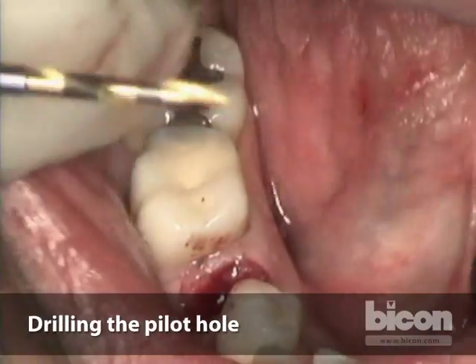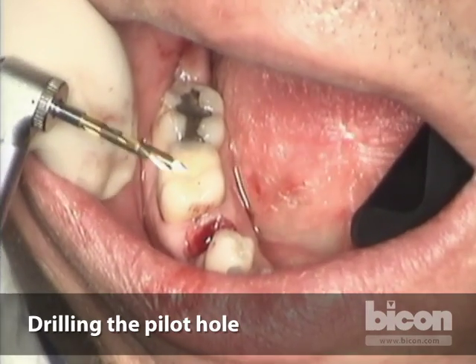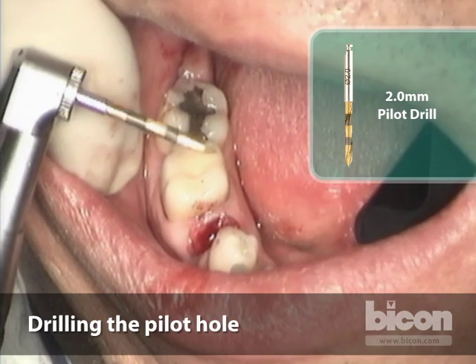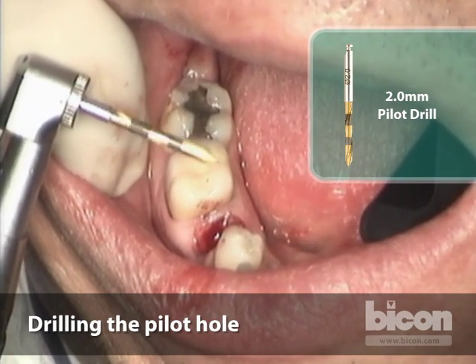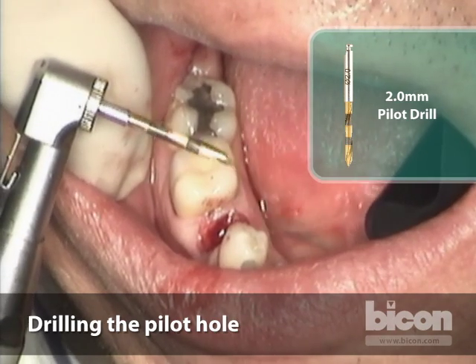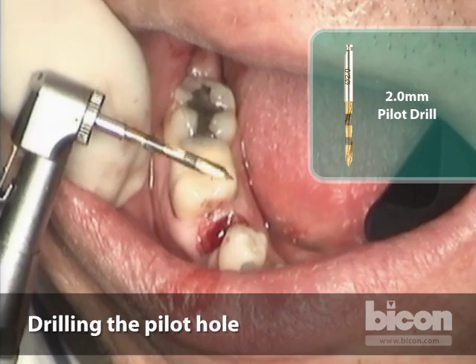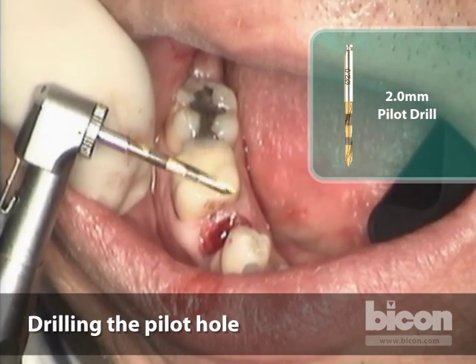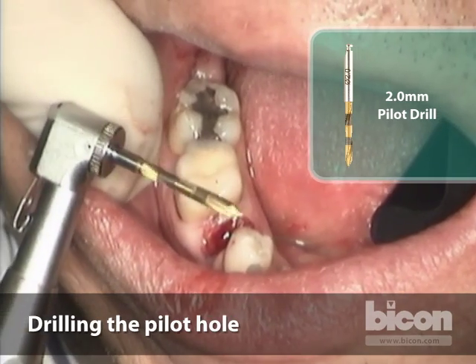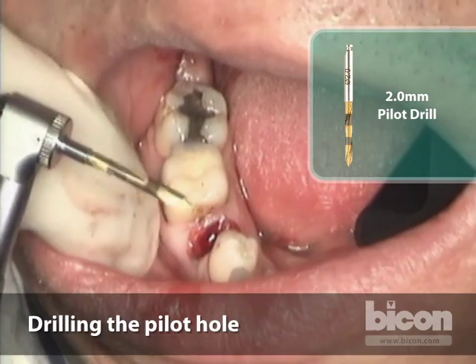The pilot drill in the Bicon system has two broad bands. The first is between six and eight millimeters, starting exactly at six and ending at eight. The second band starts at eleven and ends at fourteen millimeters. The drill itself is very sharp and externally irrigated.